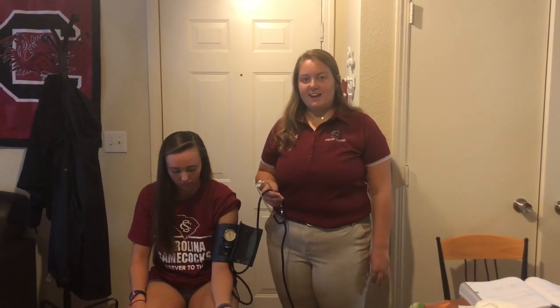Hi, I'm Lex Matillo, a third-year athletic training student at the University of South Carolina. Today I'm going to teach you how to do blood pressure.